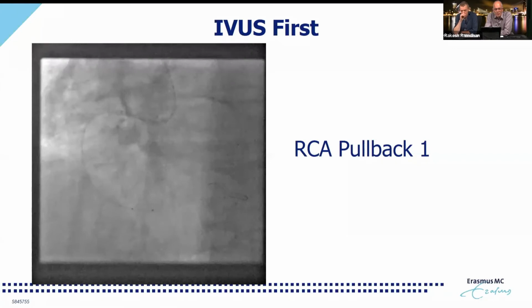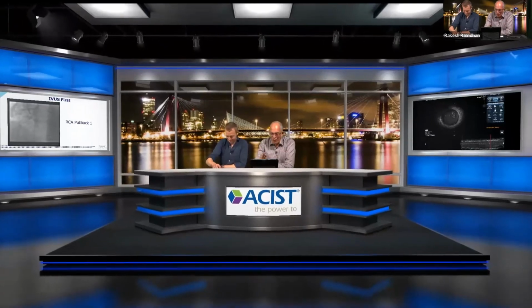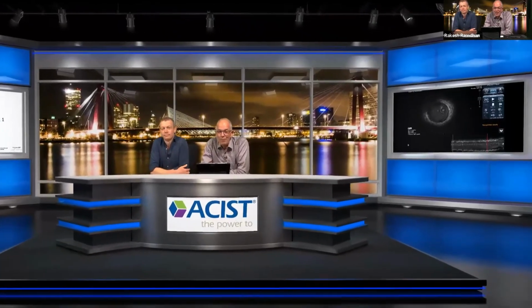What you can also see is that in all of these pullbacks, the first pullback, we always start distal in the vessel. Never start your pullback in the plaque or in the thrombus. Use live imaging when you advance the catheter so you know where you start the pullback. And the basic principle, specifically for the first pullback, is to always start in a healthy distal reference segment, if there is a healthy segment. Here we started in the distal right coronary artery.